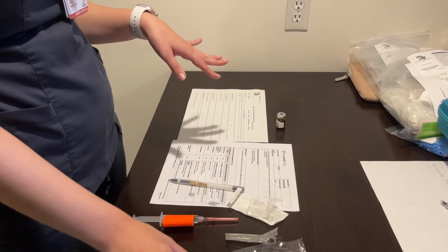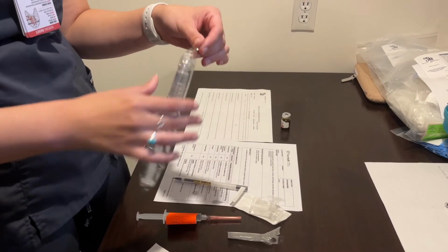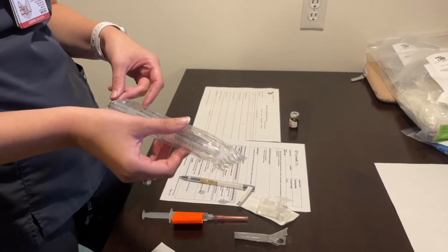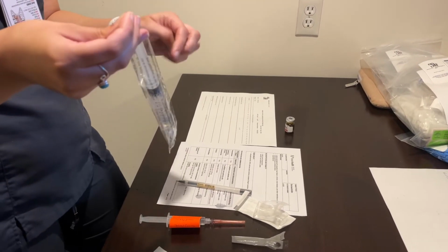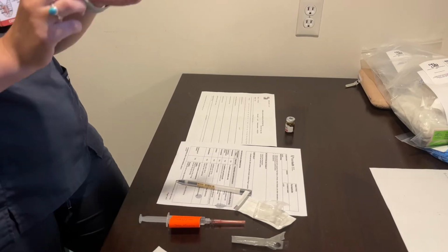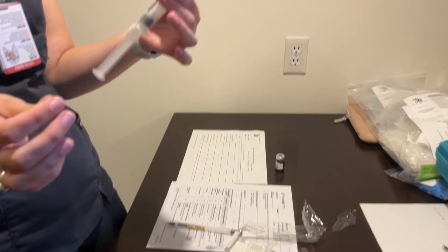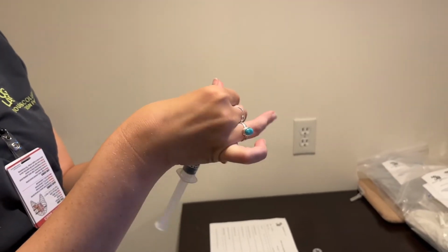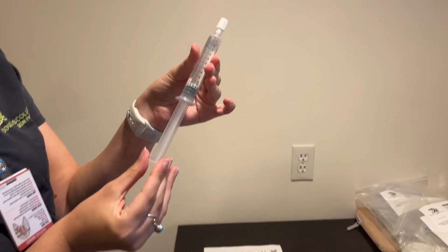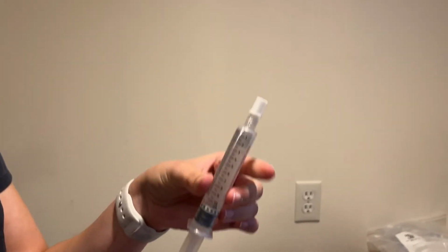So we are going to prime the saline flush just before we go into the room. So I'm going to open it. Now what I'm going to do is I'm just going to crack it open a little bit, push back just so there's a little bit more resistance.